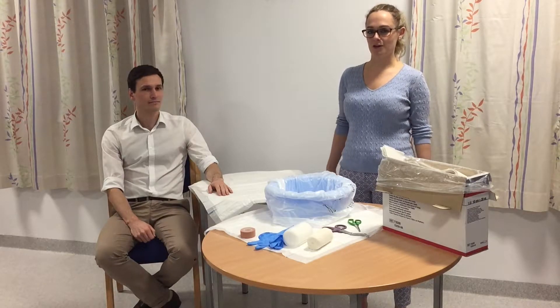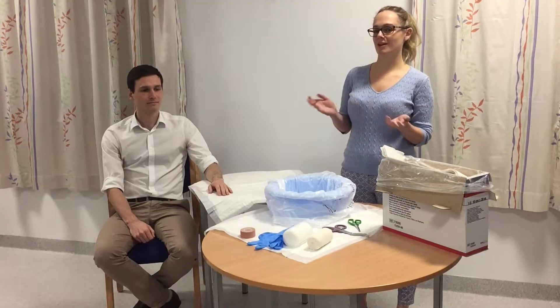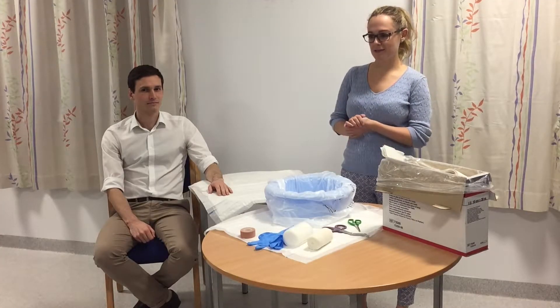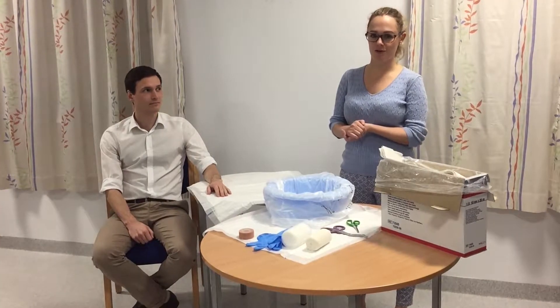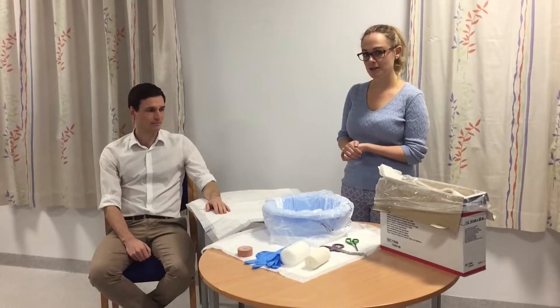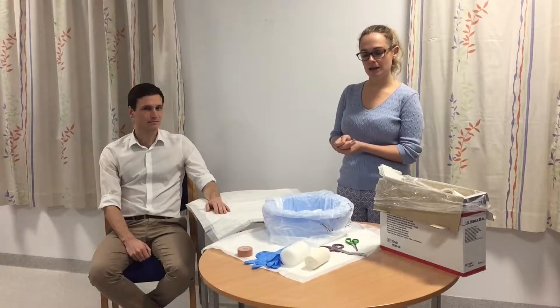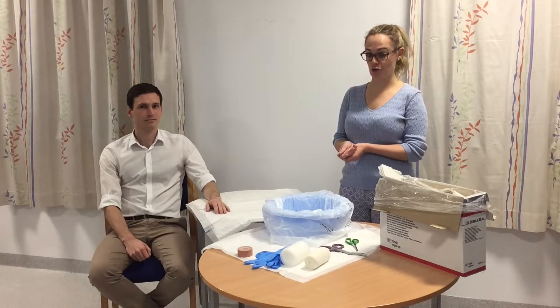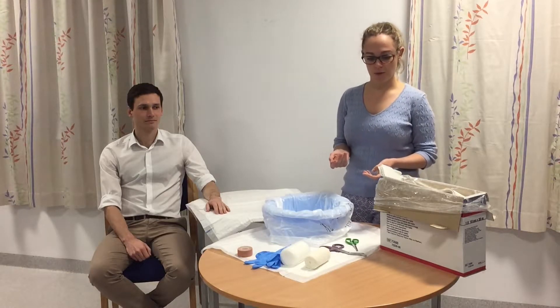Today we are going to put a volar slab on, which is something I had never heard of at medical school, but it seems to be quite common in acute management for people who have hand fractures. It helps stabilize the hand, and you really need to know how to put one on, especially if you're going to be working in A&E or in any sort of hand trauma.